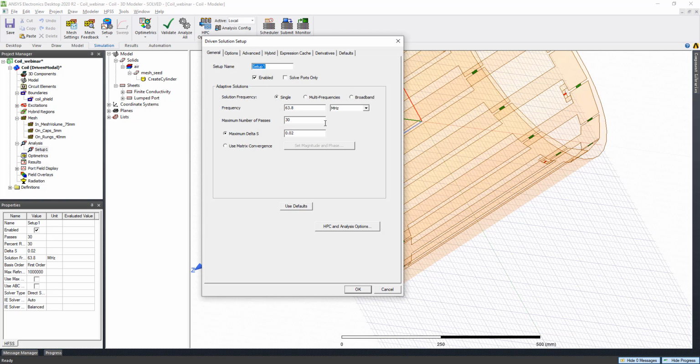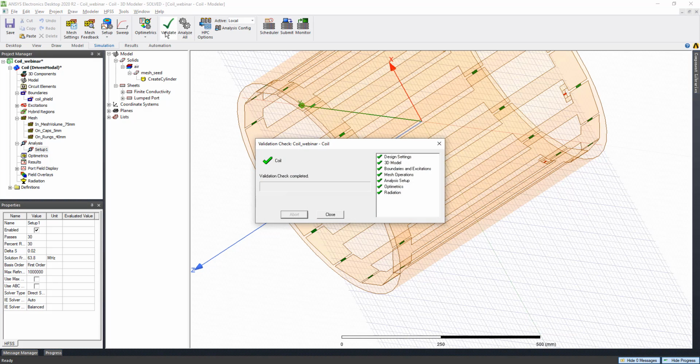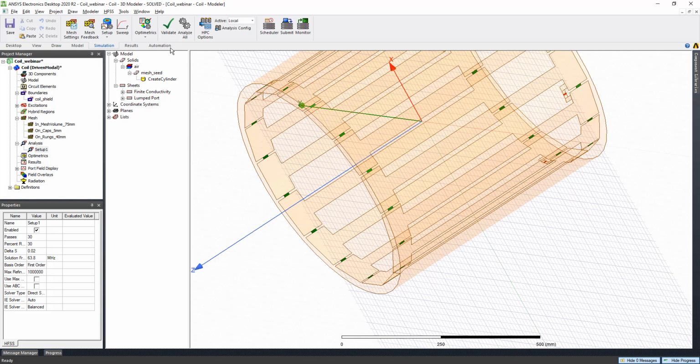Then we have the setup here. We set up a number of iterations that you want to run the simulation. But as soon as the simulation is converged, it won't run any more iterations. So this pretty much looks good, and you can go ahead and validate your design. Once everything is green, we can go ahead and analyze it.